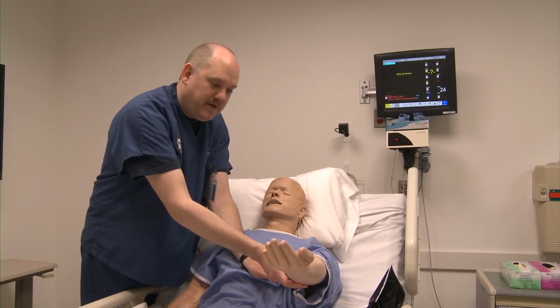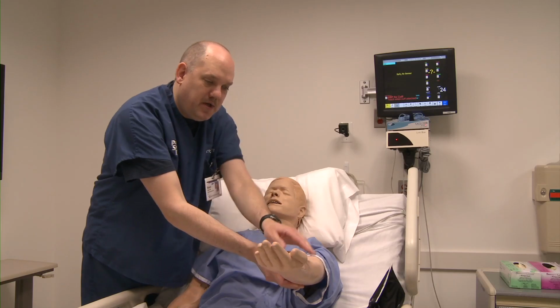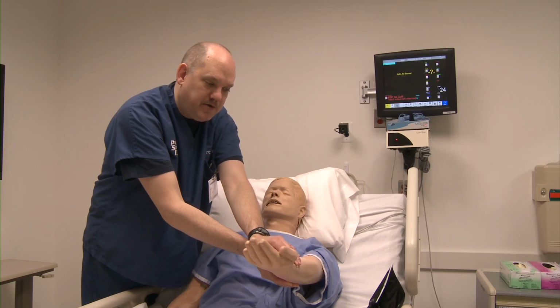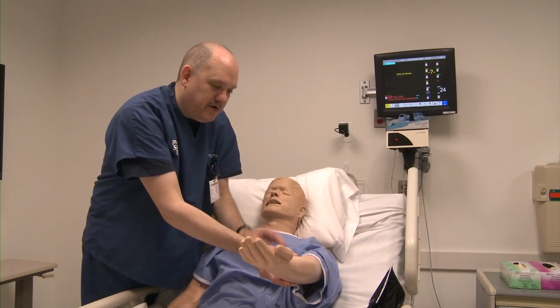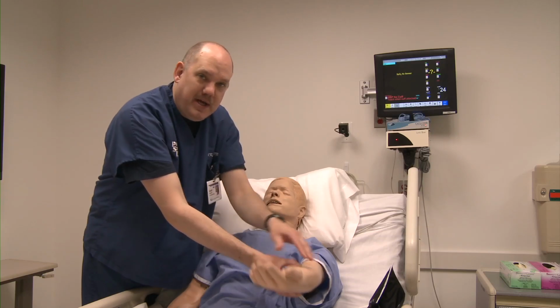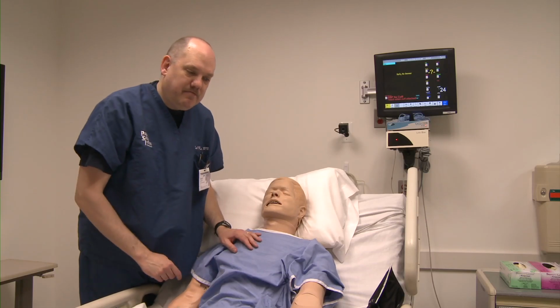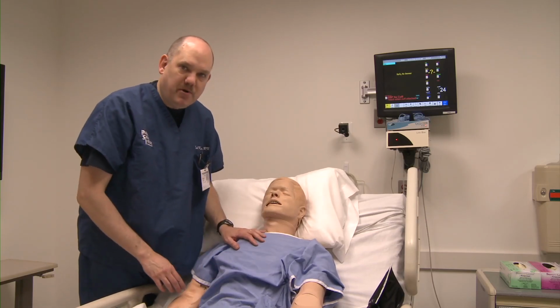Both of them are touch activated, which means once you press the soft pad on the arm, it may take a moment or two for the pulse to actually start pulsating so that you can feel it. On any of the peripheral pulses, if you press more than one at the same time, it will shut off the pulses altogether.